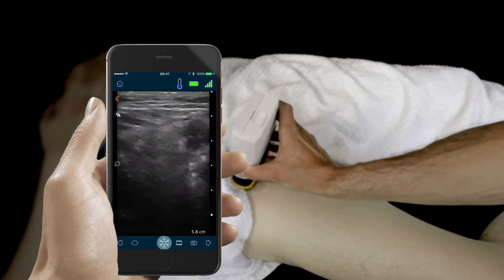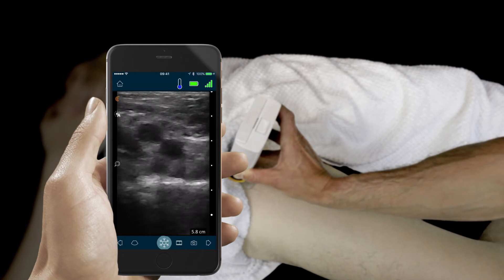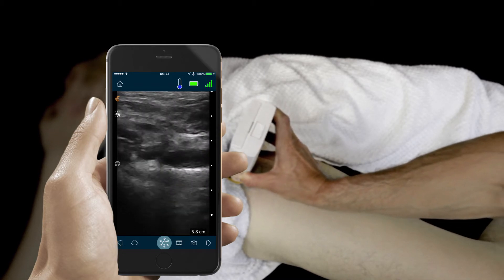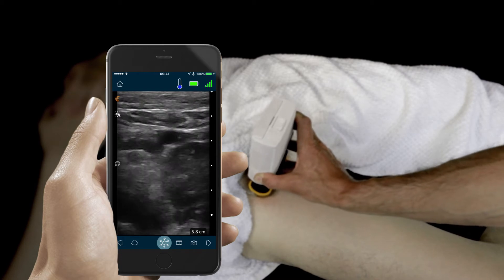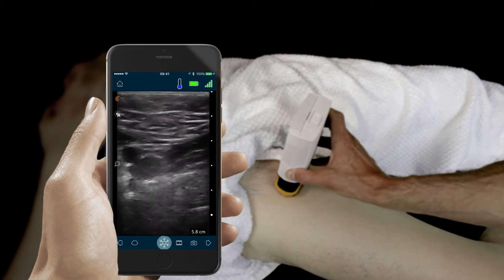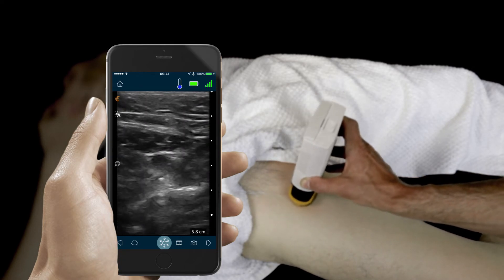For the first part of the DVT scan we'll use our scanner to examine the femoral vein just proximal to the saphenous vein. We'll compress the vein ensuring that it compresses completely all through the inguinal fossa. We'll repeat the compression every centimeter or so.